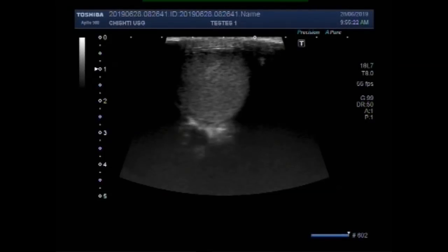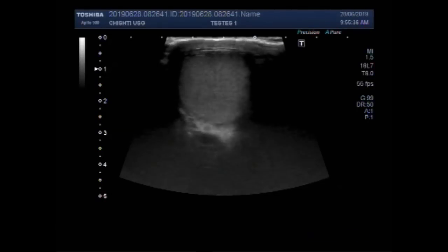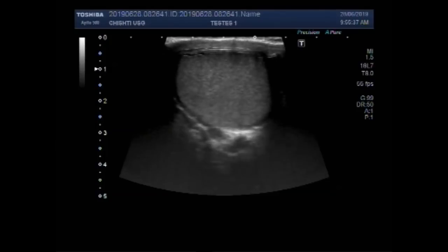Dear viewers, I hope you are all fine. This ultrasound video shows a pyocele of the testes along with torsion of the testes.